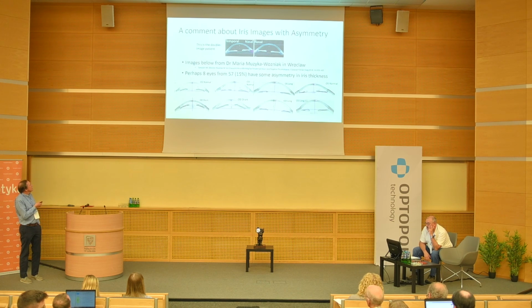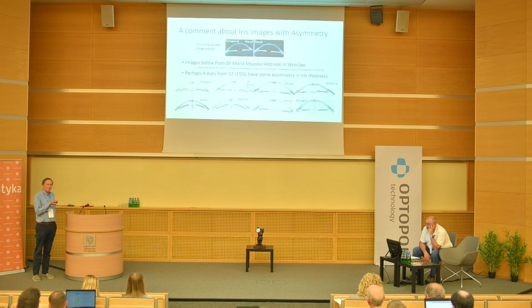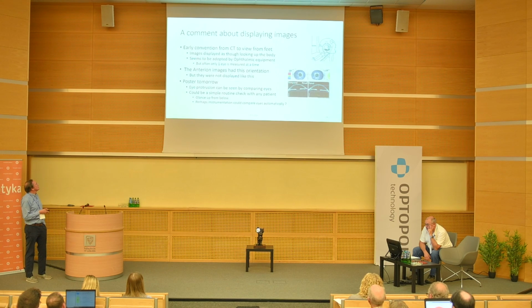So I had these images and I went through them, and some of them have kind of a thicker region on one side rather than the other. I thought maybe 10 to 15%, without doing any study of it. I don't know if anybody's seen something like that before. I don't know if it's a family characteristic, and that's why I asked Dave whether she comes from a family with a particular historical background that might lead to this characteristic in both her eyes. It hasn't been asked yet, but maybe when the patient comes back, they might ask.